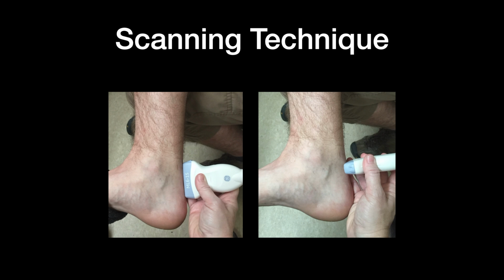So what I'd like to do with the duration of our time, and we will go a little bit short today, we don't have to fill our whole time today, is specifically focus in on the ideas of cellulitis and then the idea of abscess, and see how the ultrasound can really help us identify which process is going on, right? And how to differentiate the two when we look at the patient.